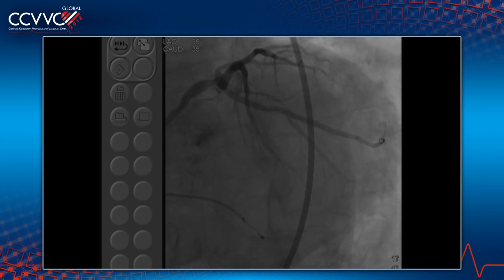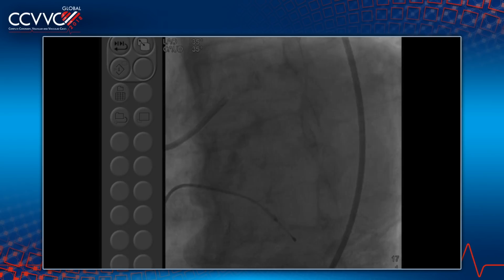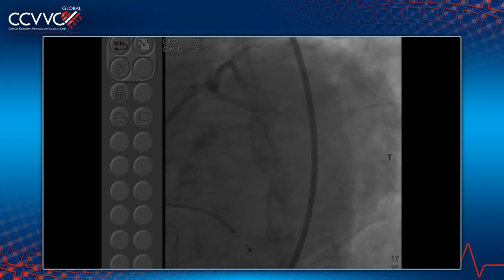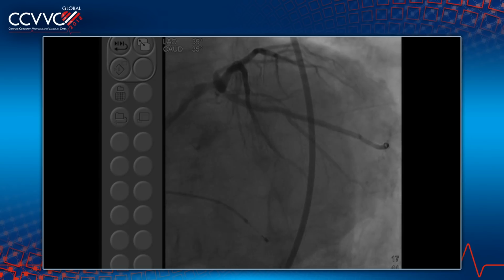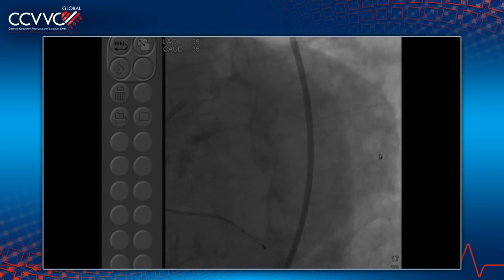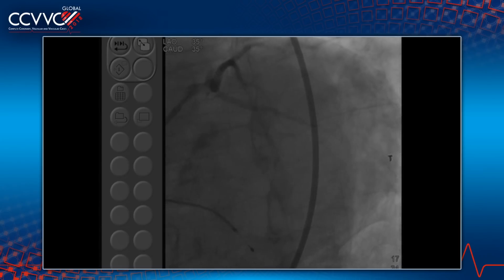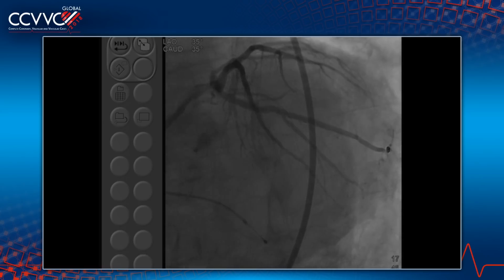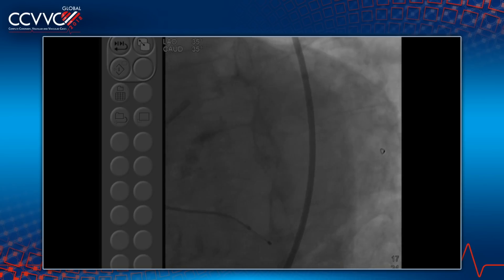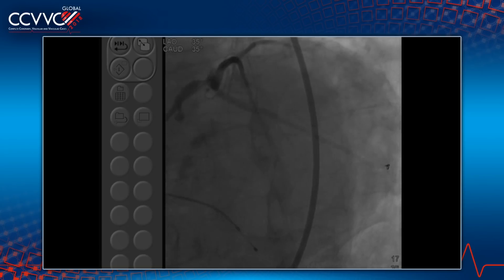Raj, you have a large volume. Tell us about how you approach this. If the ostium of the left main is involved, then you really have to go back and preferably do both at the same time. But if the ostium is not involved and it's the bifurcation here, we would still try to do this at the time of TAVI, because you have the security. This patient can become unstable, and if everything is ready, and the heart-lung machine is there, we would do the left main first, and then just continue with TAVI.